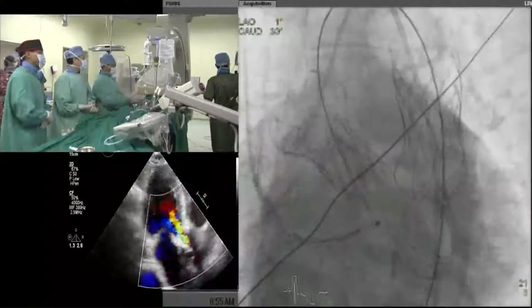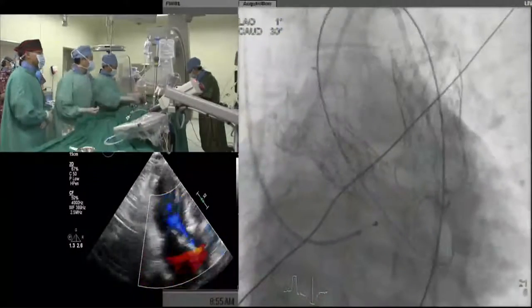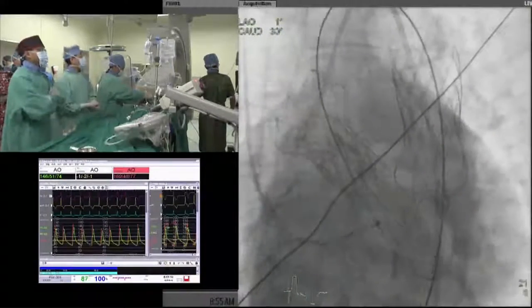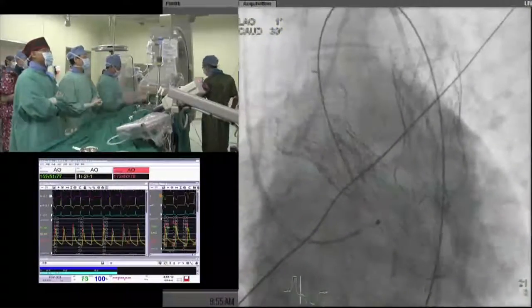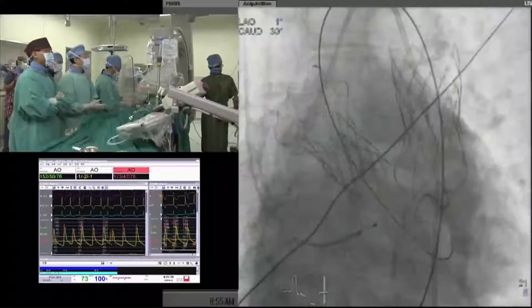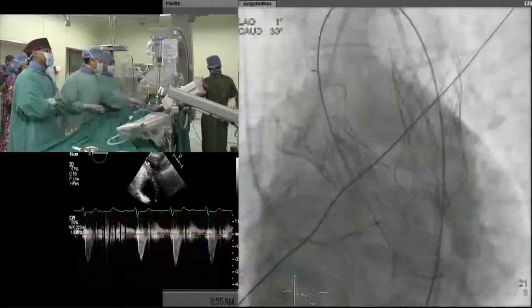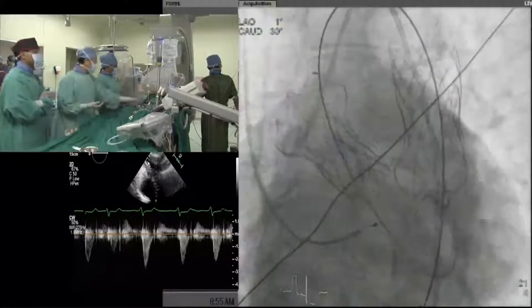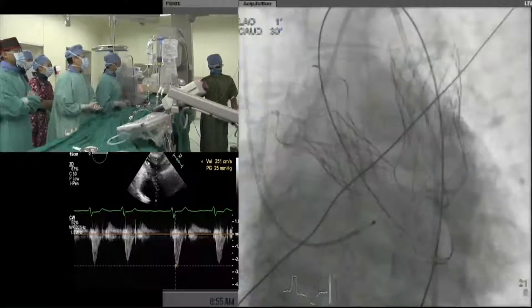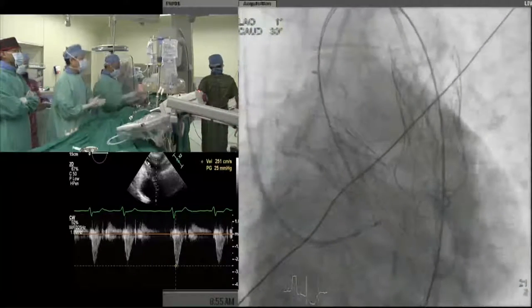Can I see the diastolic pressure? Can you hear? There's a lot of AR. Much better than before. Now the diastolic is 55. On the septal side, the device is moving up, especially during release, in the later phase of rapid deployment. I think blood pressure is much better than before. The valve velocity of the aortic valve was just 2.5 meters per second.